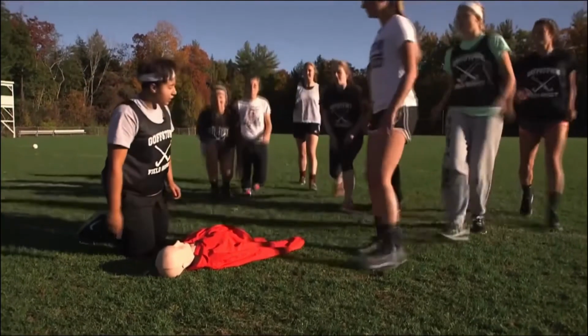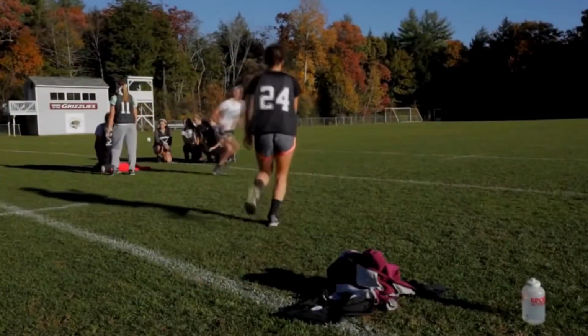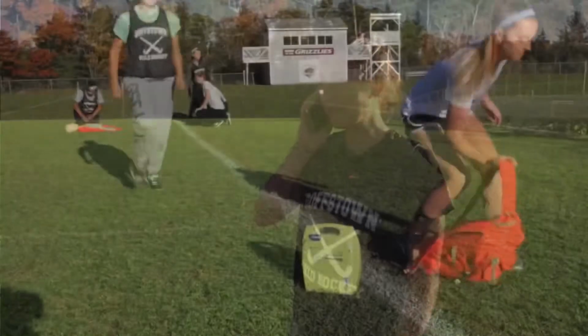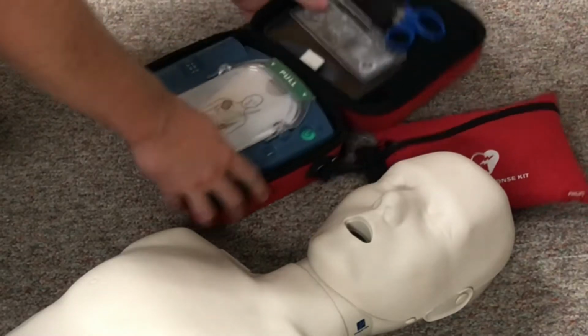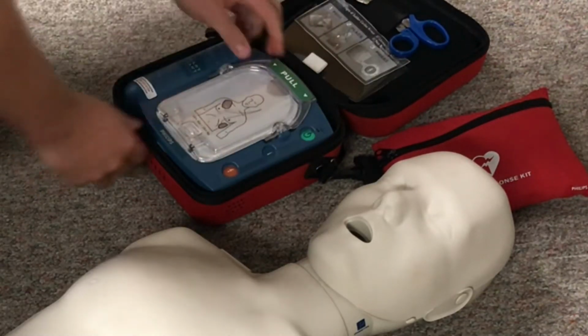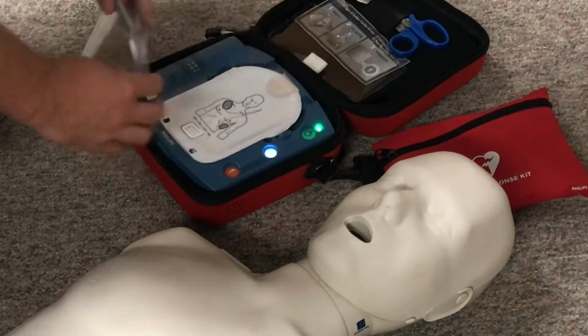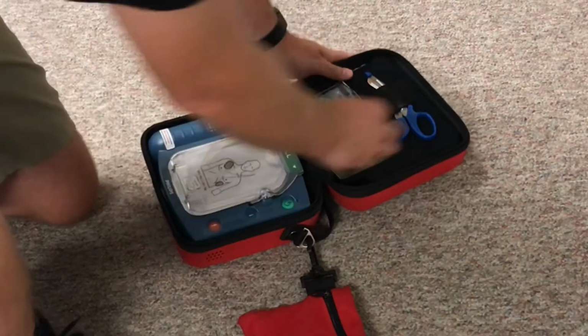In the event of a cardiac emergency, one person should begin CPR. Another person calls 911, and another person retrieves the AED. Once the AED is on scene, open the case and/or push the on button and follow the automated instructions. The victim's clothing must be removed for the pads to be placed on a bare chest.